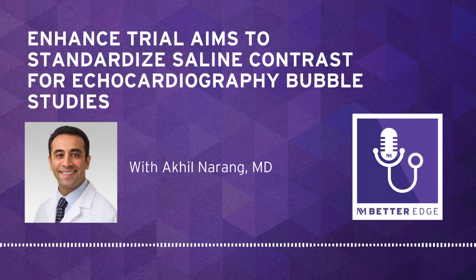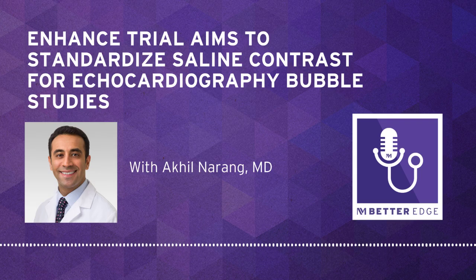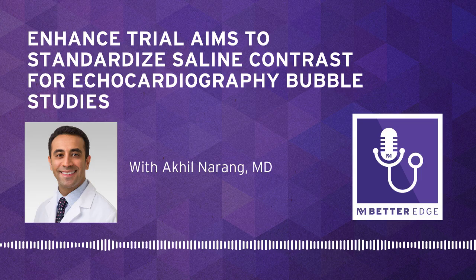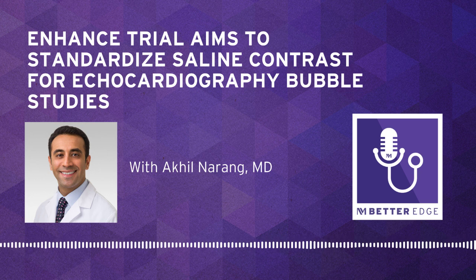Sure, absolutely. Thank you for having me. So bubble studies are a fundamental component of an echocardiography exam in certain situations. They are performed usually when there's a suspected right to left shunt, for instance, a PFO or an atrial septal defect. But we also use it for evaluation of unexplained hypoxemia and also stroke or systemic embolism of unclear etiology. So there are multiple indications in which a provider might order an agitated bubble study or saline study.